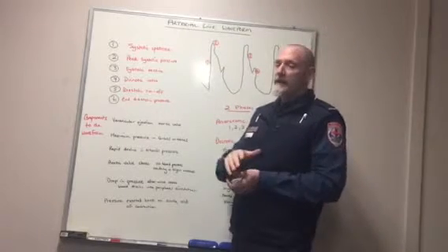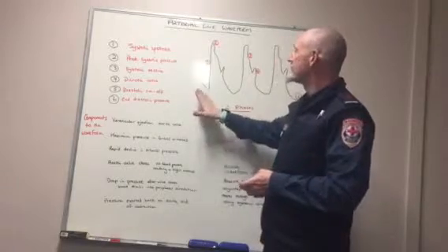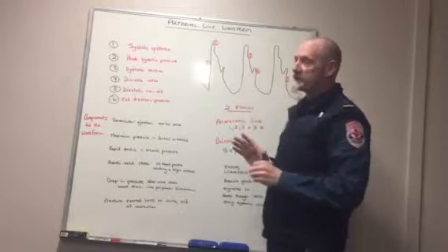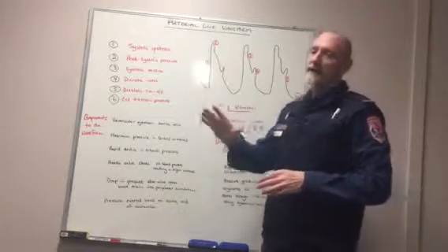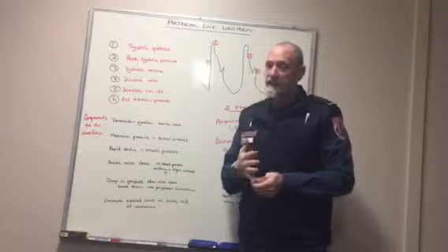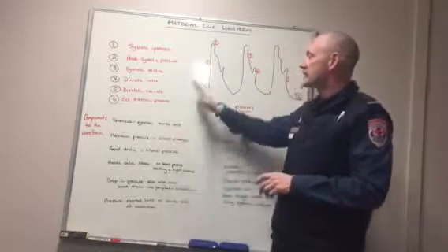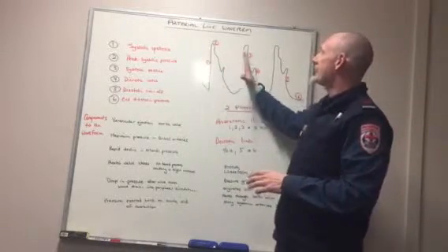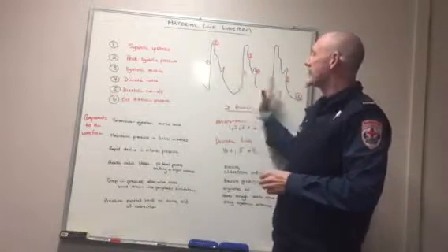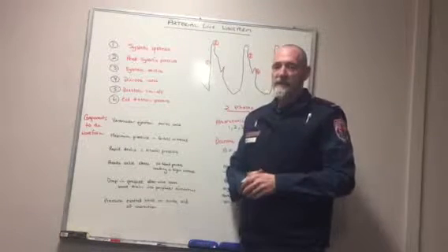I hope it's piqued your interest in some ways to go and have a look. This is ideally what we're wanting to see from the art line, but depending on whether there is a leak or a block within the actual system itself, the waveform will change. And that's my challenge to you: go and have a look at some variances in waveforms and see what you come up with.